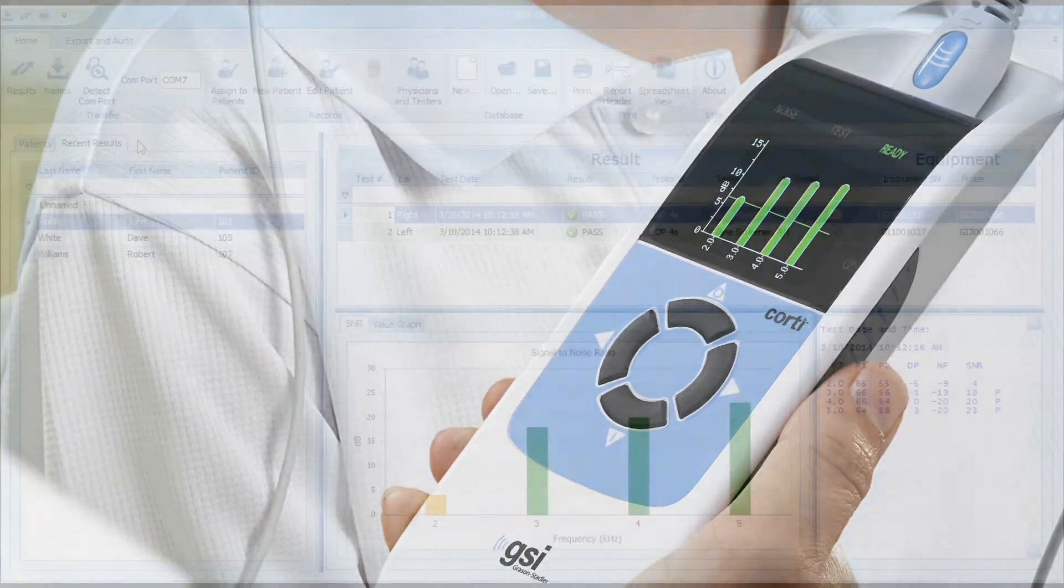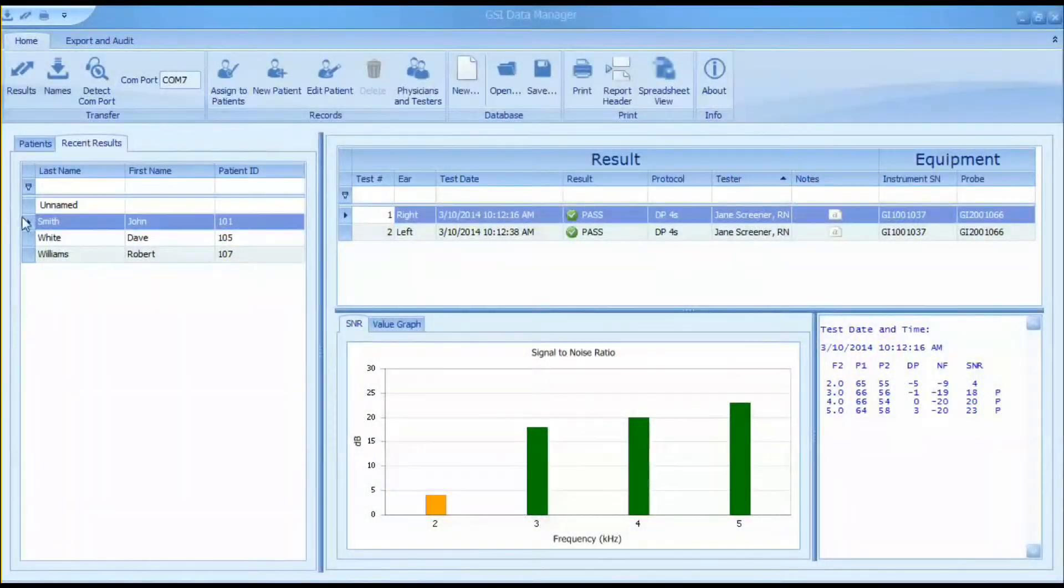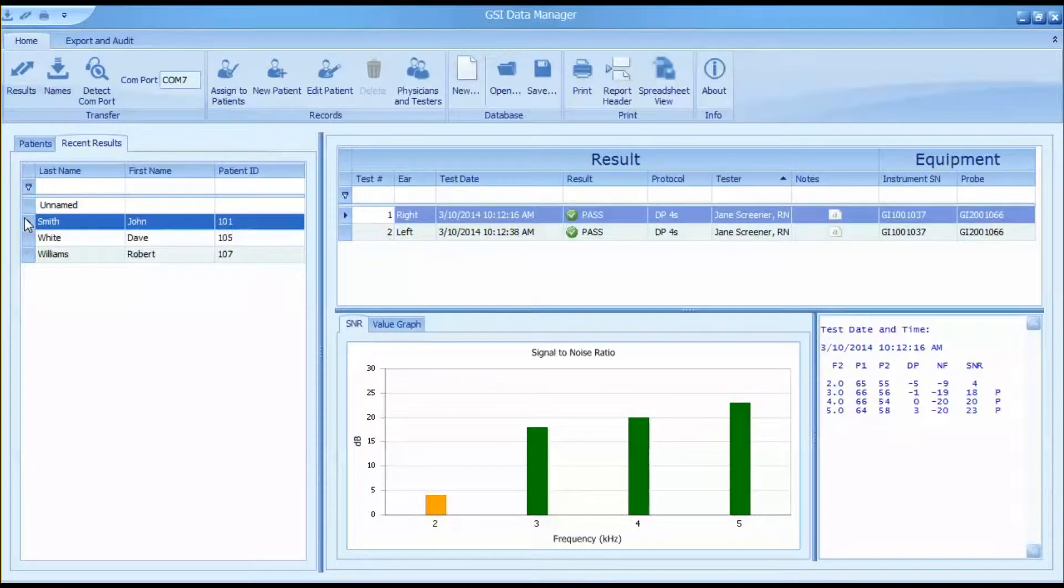When a patient name is highlighted, all of the test results associated with that patient will be displayed in the result window on the right side of the screen.